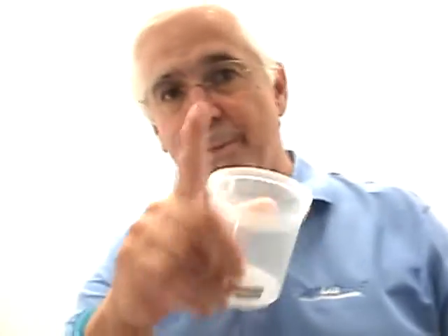and this is the container that you're going to urinate in. So what we're going to do is shut the door, and the cameraman's going to stand right outside. Okay? And what we do is wait right outside to listen to make sure we don't hear somebody lifting the lid. Ta-da! And you've got to trust me, we've urinated.